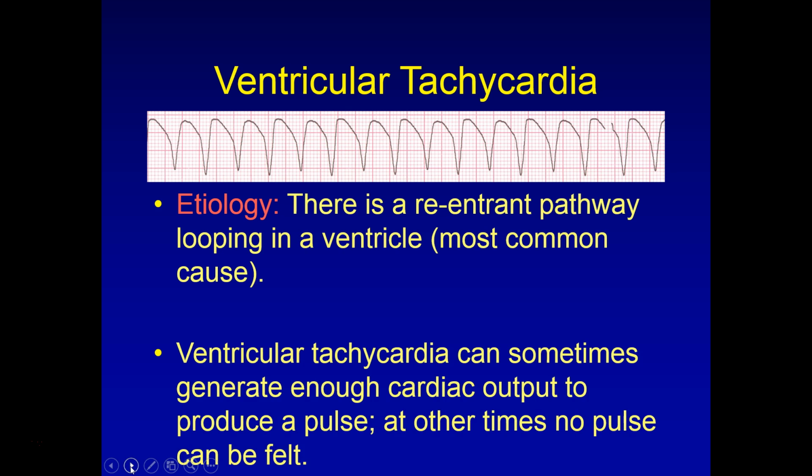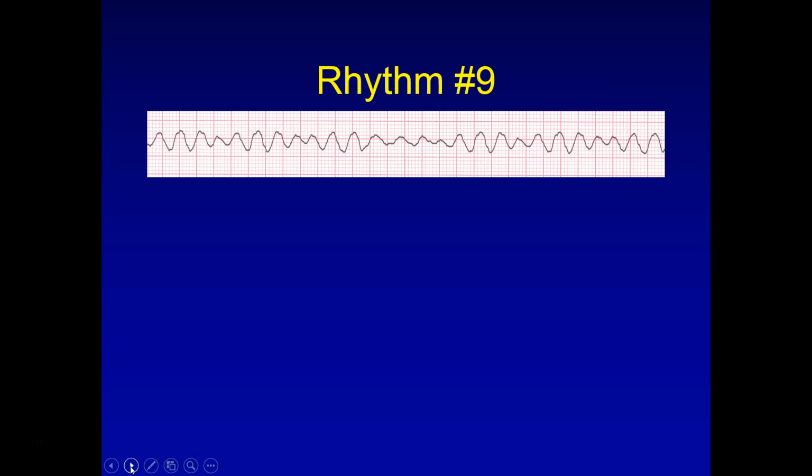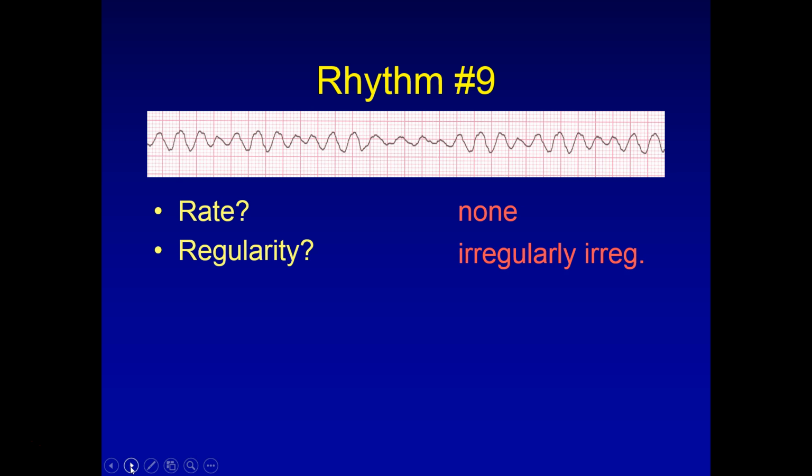And again, sometimes it can generate enough cardiac output to produce a pulse, and at other times, no pulse can be felt. So, okay, this is easy. Everyone should know this. This patient is not going to have a pulse or blood pressure, most likely, if the rhythm's correct.